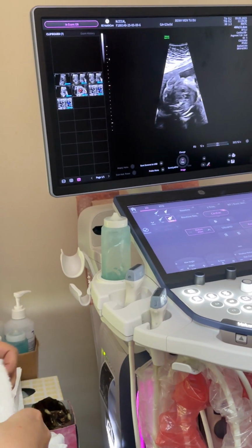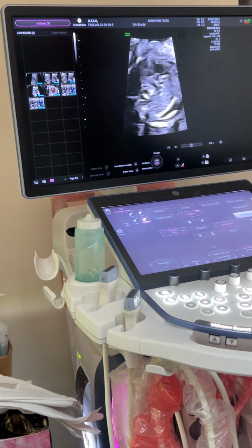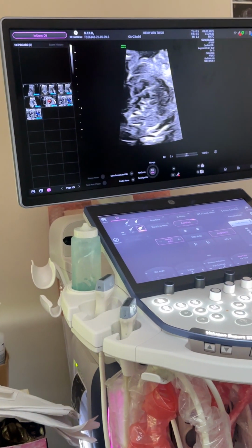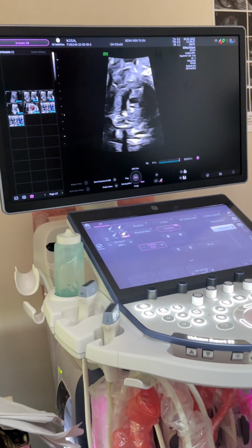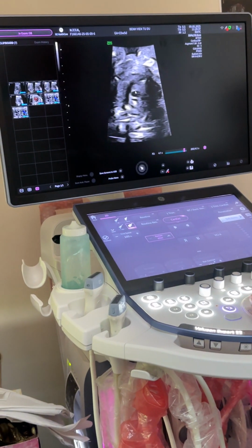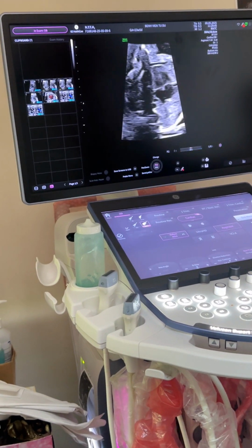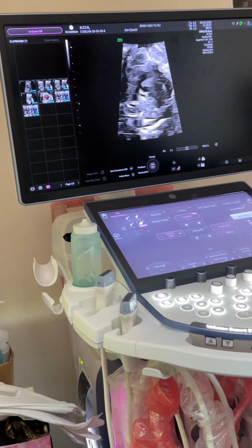So, next I want to look at the pulmonary artery. So as I look at the pulmonary artery, this is different to the last case because I can see a normal pulmonary valve. The last case, the pulmonary valve was thickened, but this is a normal pulmonary valve. Still, I want to look with color Doppler examination.